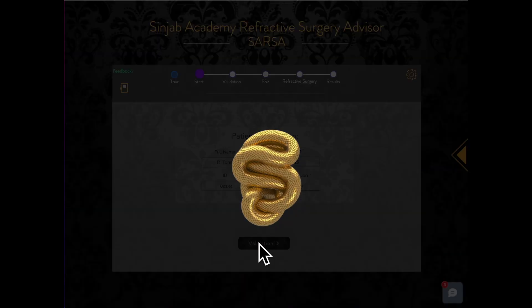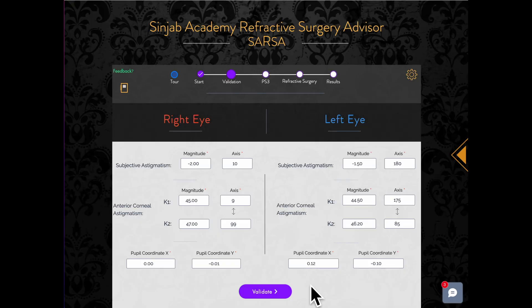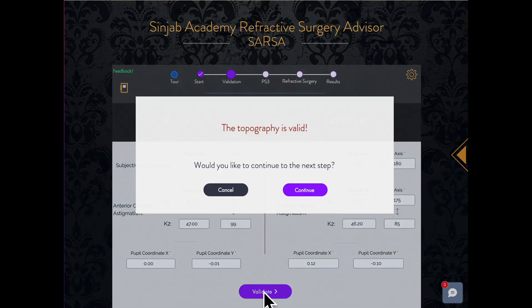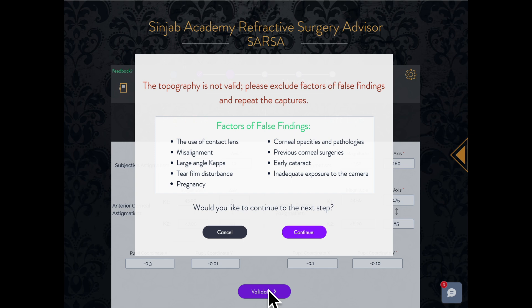In the validation step, Sarsa validates the topography and checks its reliability. If the topography is invalid, you may need to rule out factors of false findings, as will be shown in the message.